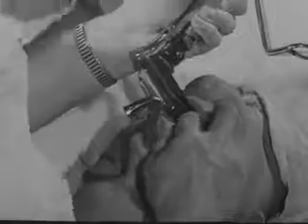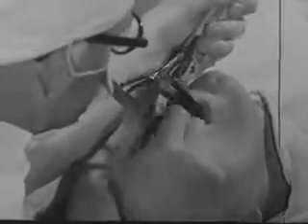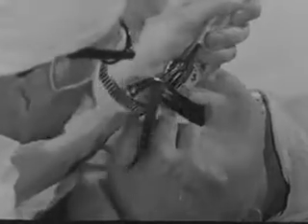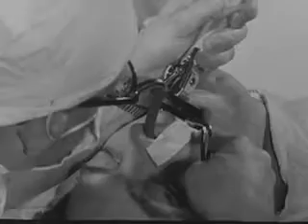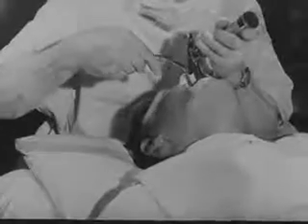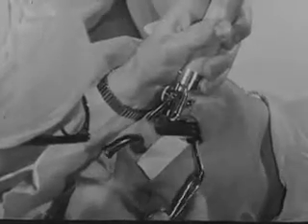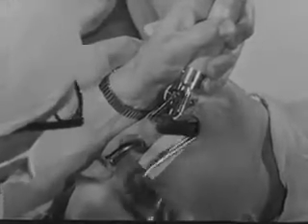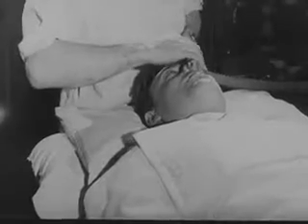Pass the laryngoscope as before, and then insert through it the angulated forceps. Then it is an easy matter to pick up the end of the tube and guide it into the larynx. When the tube is in position, the metal connection is strapped to the patient's face in the usual way.